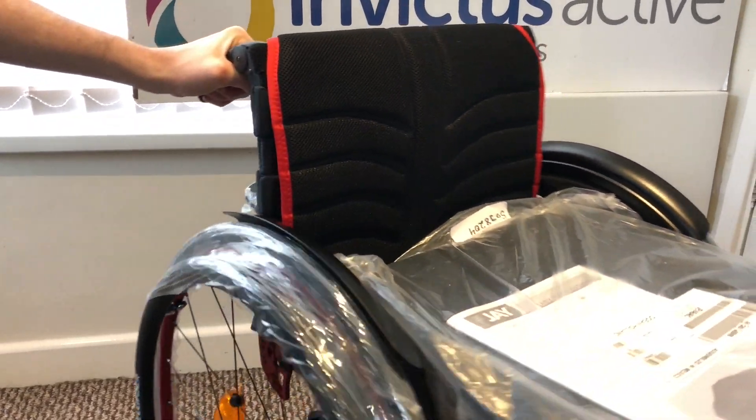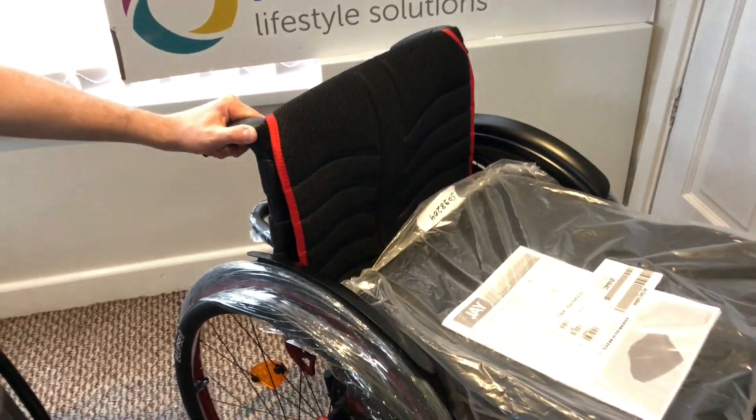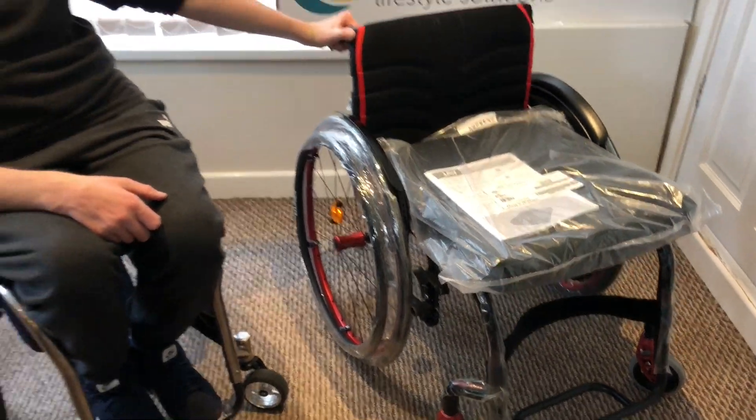Overall this has got quite a few added extras, but it's a real smart, nice Quickie Helium. Thank you.